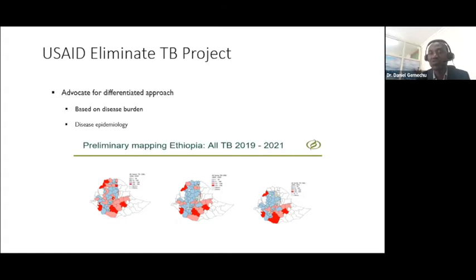And these are the areas where you can use CAD4TB and AI mounted technology to easily identify patients, as most of our patients are actually asymptomatic and we need to use the technology to assist with the gap we are having in the country. Next slide.